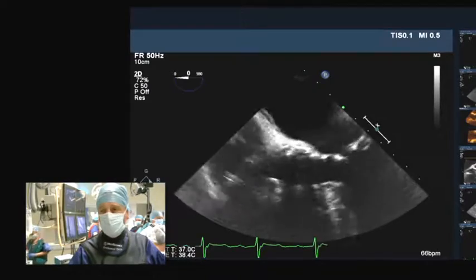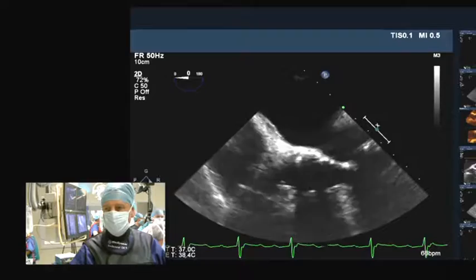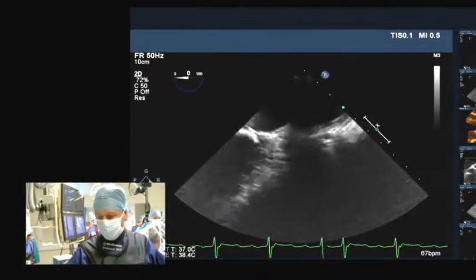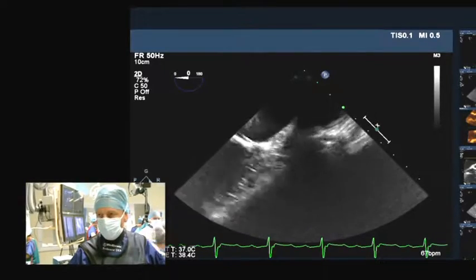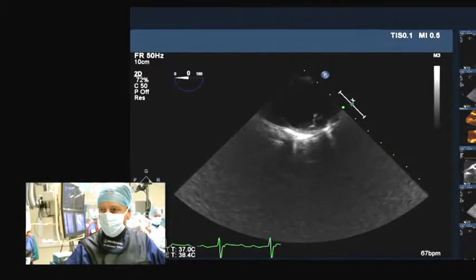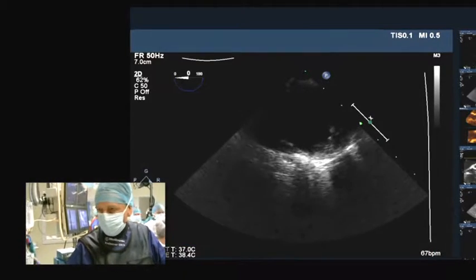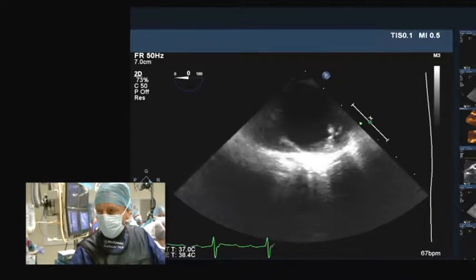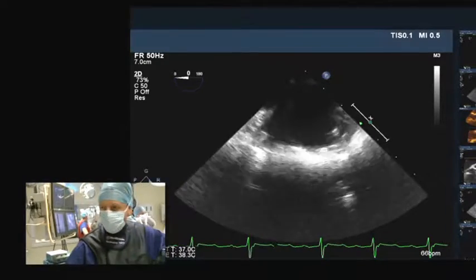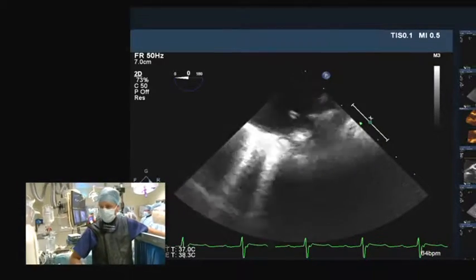This has already been done though on the pre-procedure transesophageal echo, and it's important to say that this patient's had a complete transesophageal echo done prior to this procedure as part of her workup for the TAVI. So we just look at the descending aorta, which does contain some atheroma, as you can see. So it's a fairly atheromatous aorta with a catheter still in it.